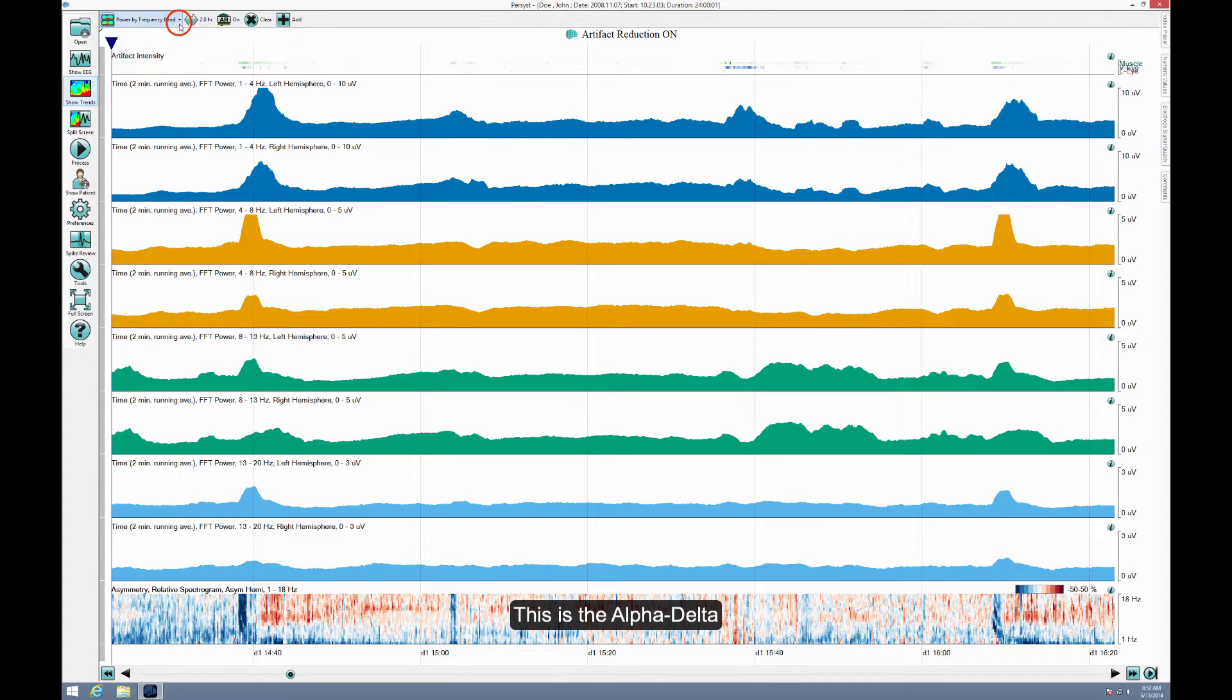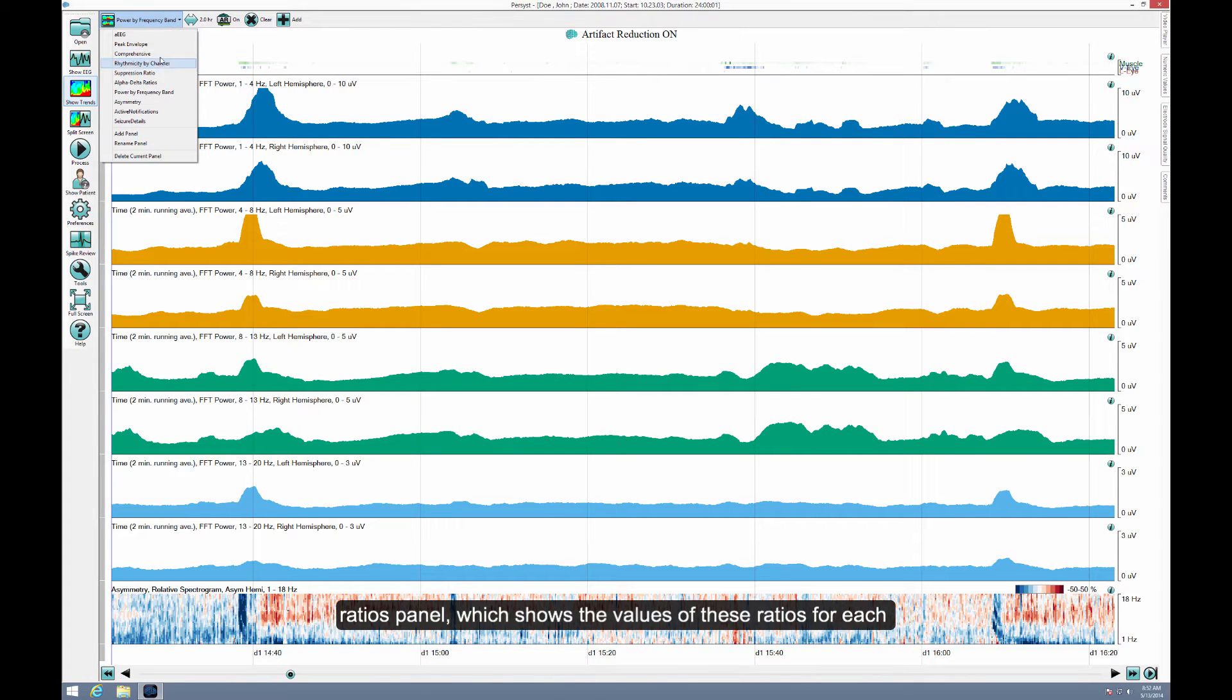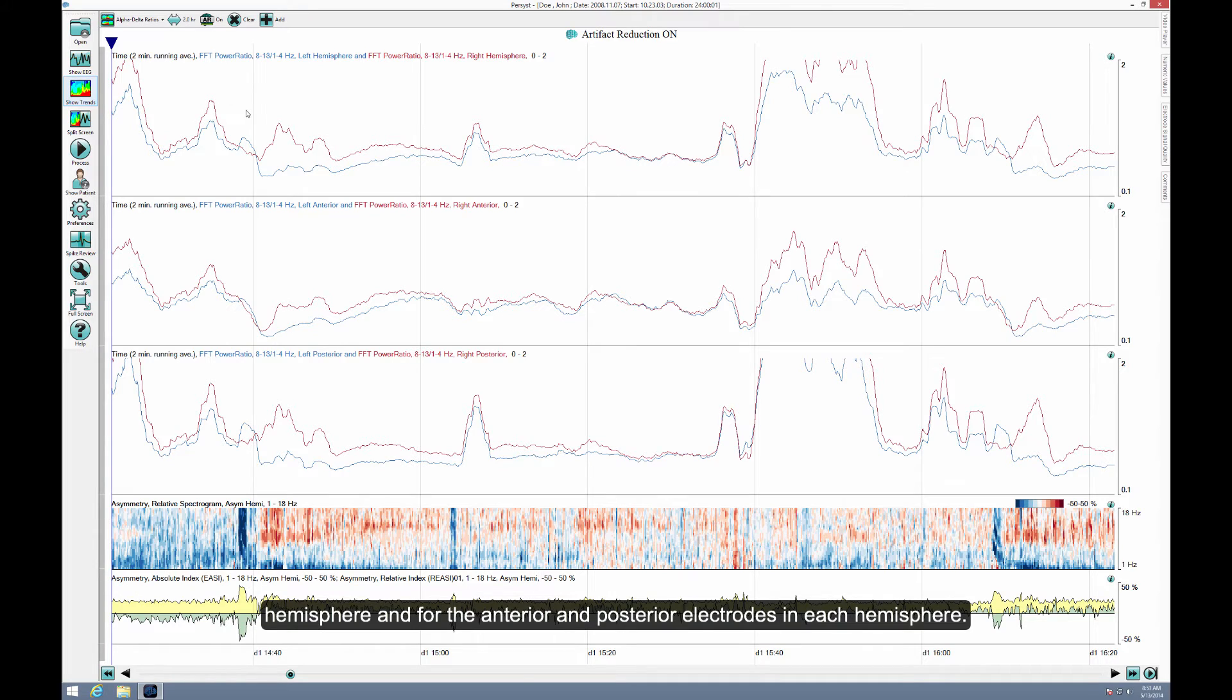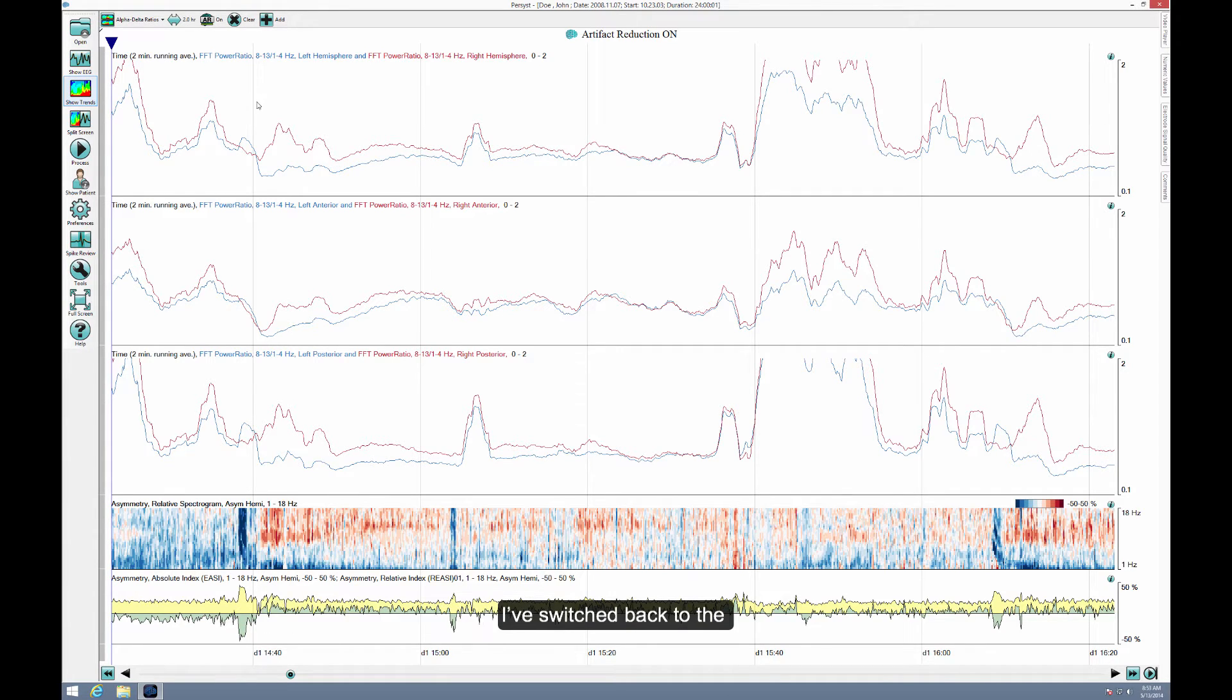This is the Alpha Delta Ratios panel, which shows the value of these ratios for each hemisphere and for the anterior and posterior electrodes in each hemisphere.